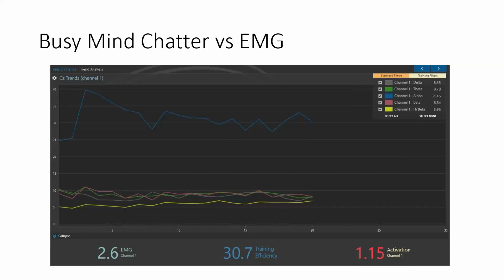All righty, everybody. We're just past the top of the hour, and we'll post this, and you can review it again at your leisure in a couple of days when we get it up there. Hopefully this has opened your eyes and given you something to think about, your considerations when training. Overall, our filter system takes care of most of this for you, but don't get fooled when you see beta, any of it, going above 8 or 10 microvolts. Just think this is probably not real.